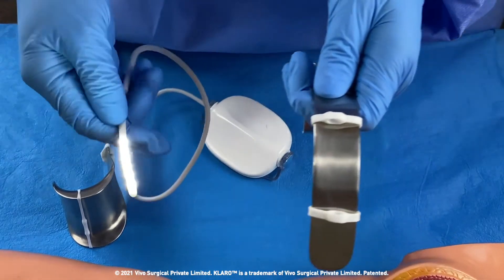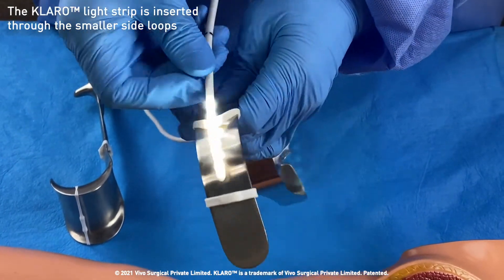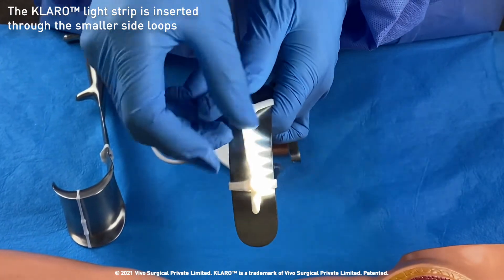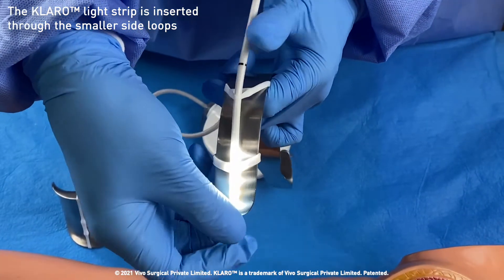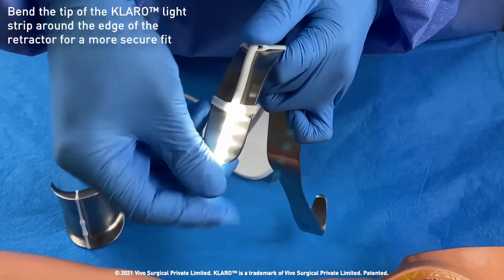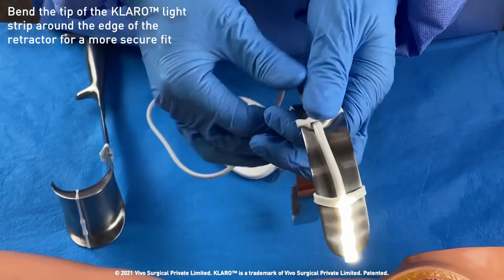Next, the Claro light strip is inserted through the smaller side loops. The tip of the light strip can be bent and secured to the bottom edge of the retractor.